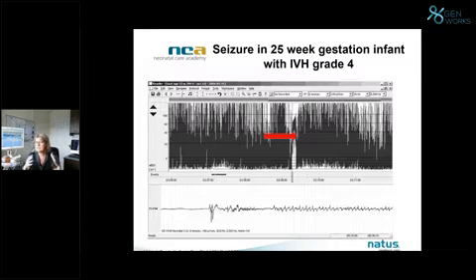So what we know about seizures on the AEEG in preterm babies is that we can identify them in the same way as we can in full-term infants. We also know, and this is important, that epileptic seizure activity, often without clinical symptoms, and I mentioned this earlier, they're often subclinical, is very common in the AEEG during the development of intracerebral hemorrhages.